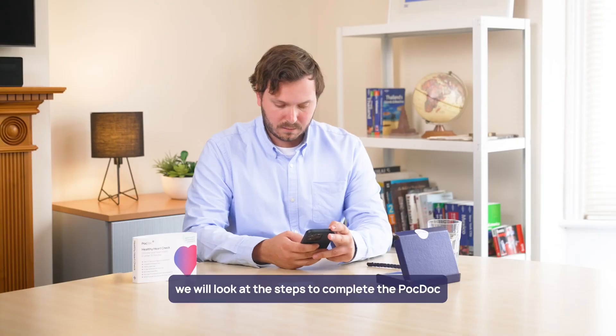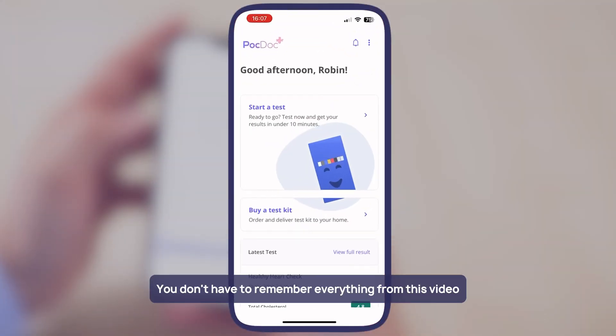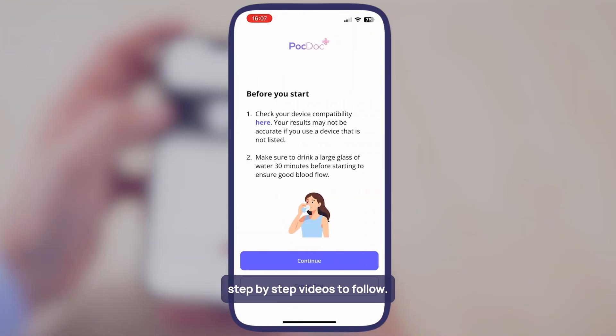In this short video, we will look at the steps to complete the PocDoc Healthy Heart Check. You don't have to remember everything from this video, as there are more detailed step-by-step videos to follow.